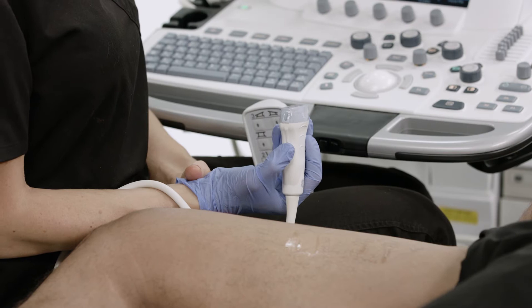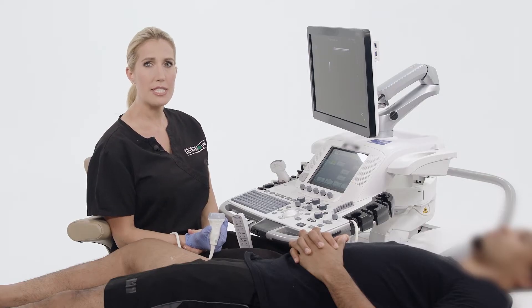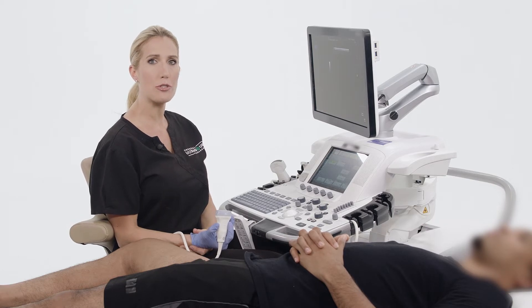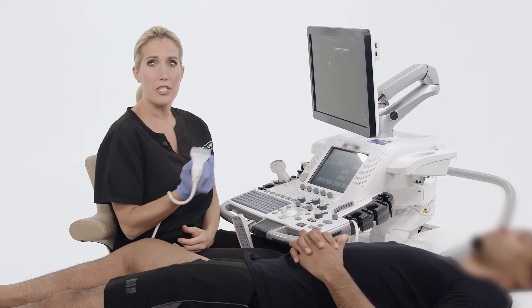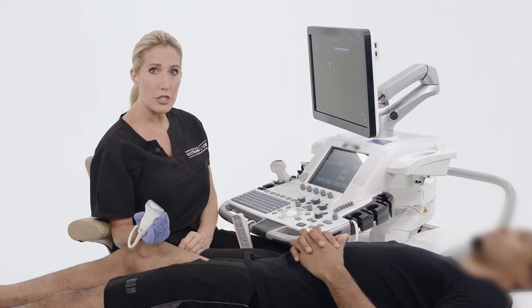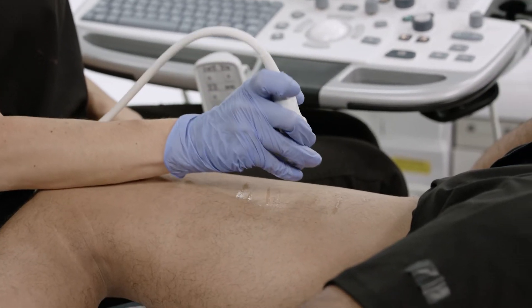The position of your arms should be as proximal to your body as possible while being comfortable. Specifically, the abduction of your arm should not exceed 30 degrees. The target vessel that we are scanning should be around the same height as your elbow, with the forearm parallel to the floor.